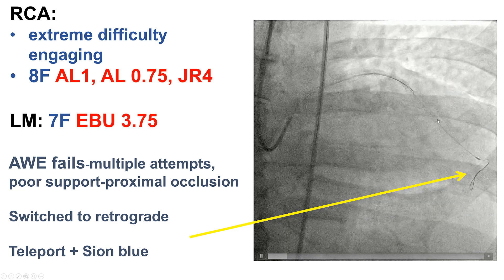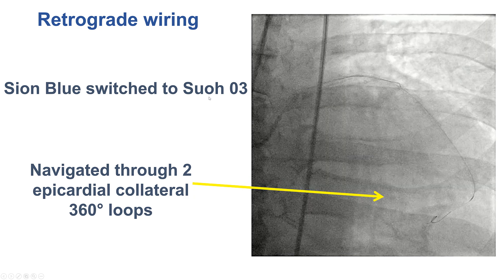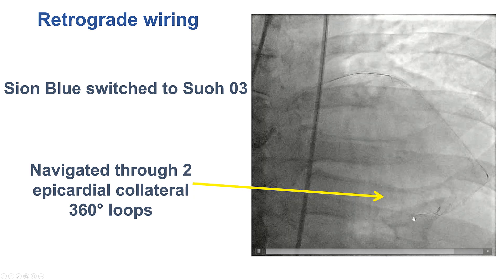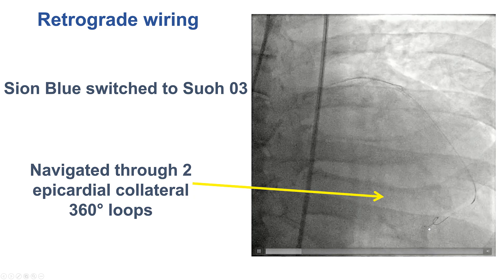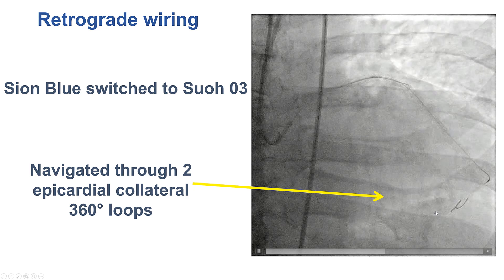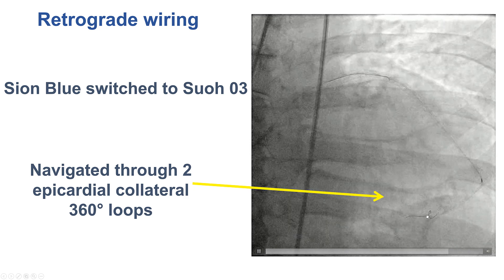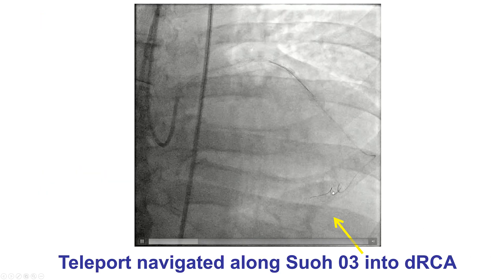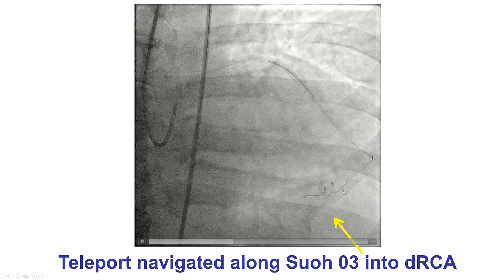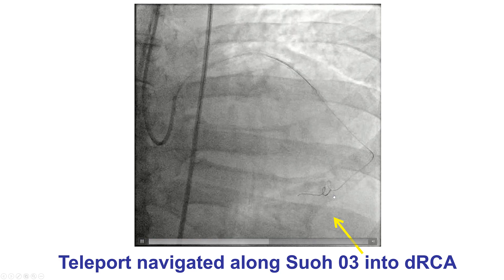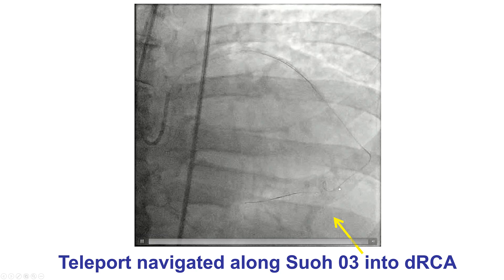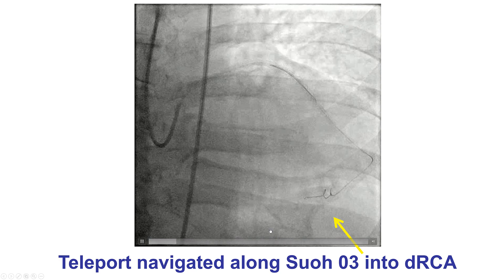We used a Teleport microcatheter and a Sion Blue wire to get to the collateral. We then used the SUO-03, which is the standard wire for epicardial and increasingly for septal collaterals, to cross through this highly tortuous epicardial collateral. There were two 360-degree loops that were successfully crossed using the SUO-03 guidewire, and those loops were successfully tracked using the Teleport microcatheter. After navigating the second loop with a slow push, there was straightening of the collateral and advancement of the wire and Teleport microcatheter.